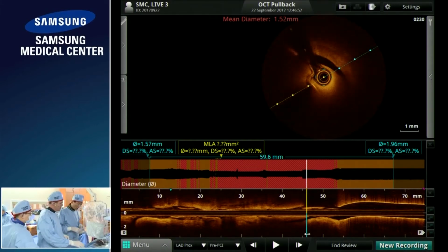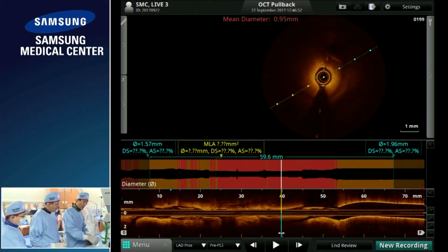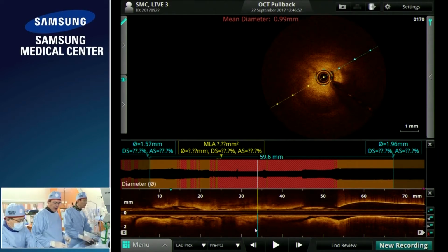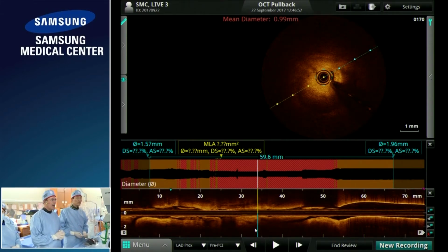Okay, shall we do some bleeding? Will OCT findings change your strategy to treat the patient? Certainly, we use a co-registration system, the Optis co-registration system, and we find that a really nice way to plan cases. So all the stent sizing we make from a single OCT run.